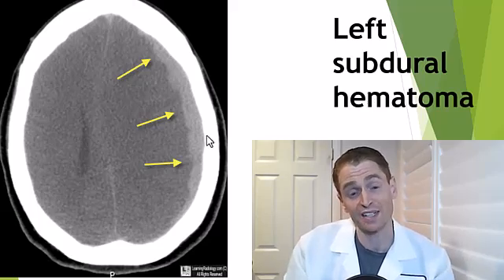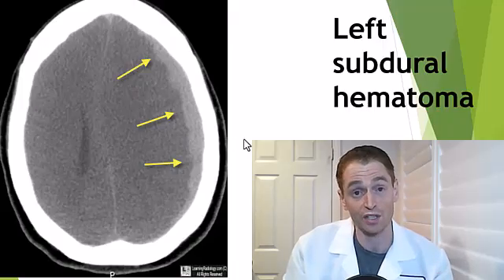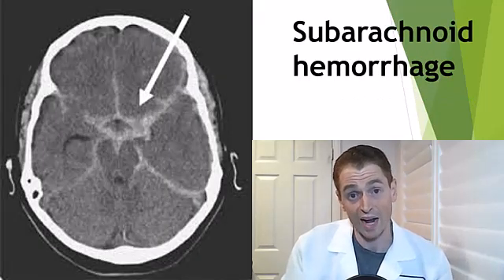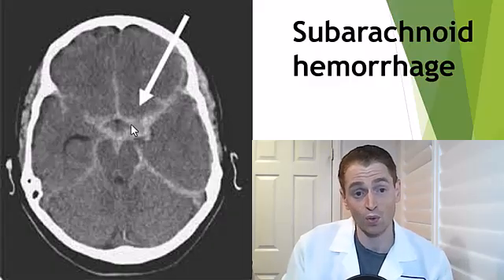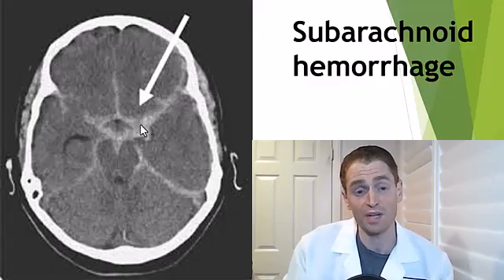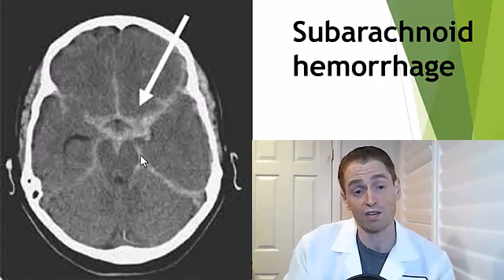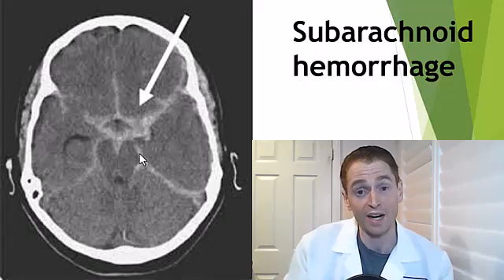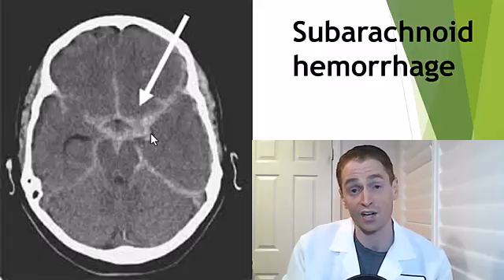If the subdural hematoma is large, as in this case, it could be treated with neurosurgical evacuation. Here is a subarachnoid hemorrhage where the blood occurs in the subarachnoid space under the arachnoid mater, a different part of the meninges. You can see blood filling up the suprasellar cistern and ambient cisterns around the midbrain. A subarachnoid hemorrhage of this type is usually the result of a ruptured brain aneurysm.